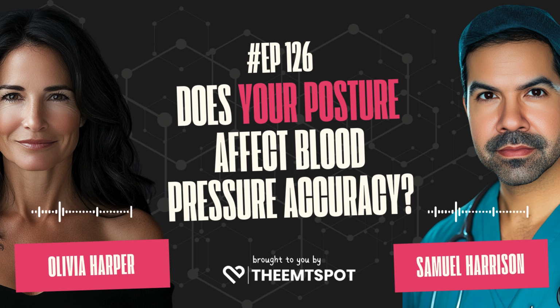But before we wrap up, I want to circle back to something you mentioned earlier. Those wearable blood pressure monitors. Tell me more about those. What's the deal with continuous blood pressure monitoring? Oh, it's such a cool development in blood pressure management. These wearable monitors, some of them are actually already out there. They use sensors to track your blood pressure all day and night.